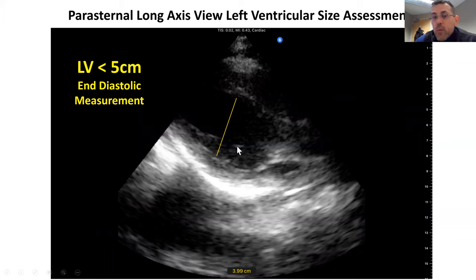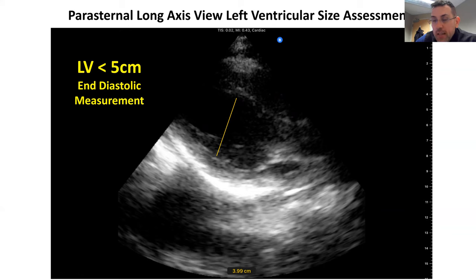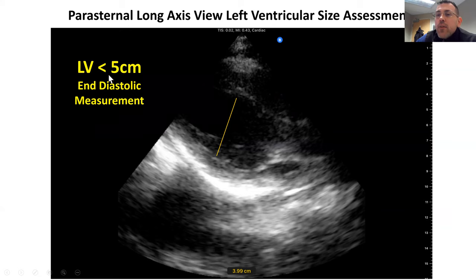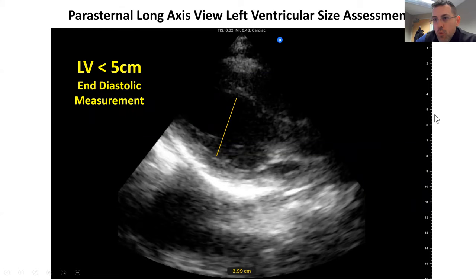We can also do this without M-mode. We can catch a video clip, scroll through, and get the ventricle when it's in maximum diastole, then draw from wall to wall across and get a measurement. Here we get a measurement of 3.99 centimeters. Again, for left ventricular size, anything less than 5 centimeters is considered normal.